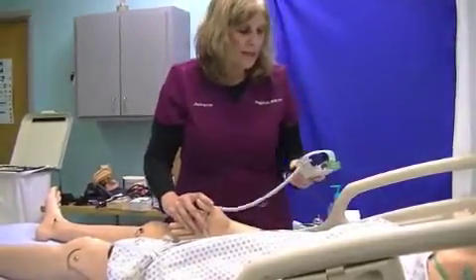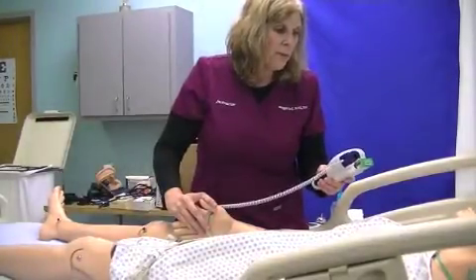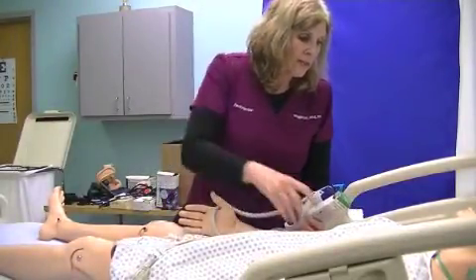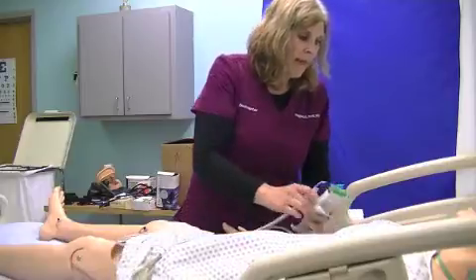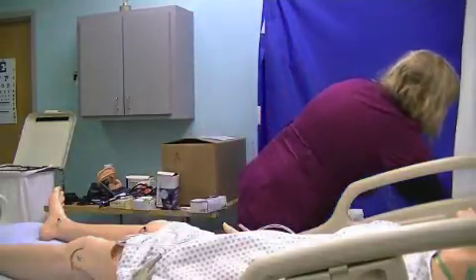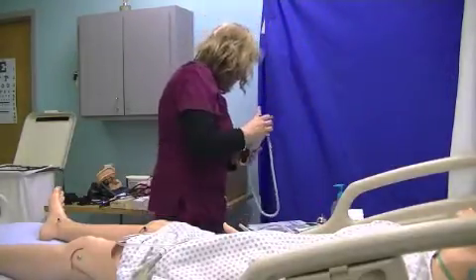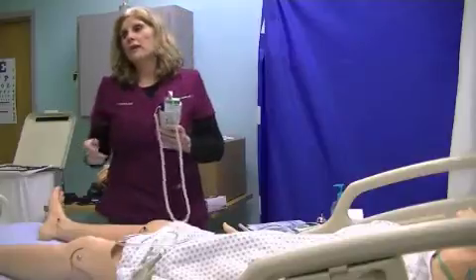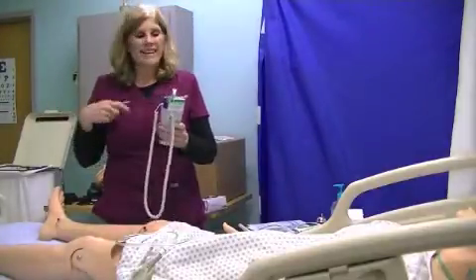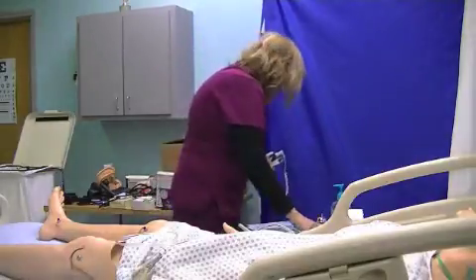Because this mannequin doesn't have a temperature to it, it won't beep, but it will actually beep when it's done. And then, of course, we can push the button to get the sheath off the thermometer and put it back in. If you wait too long when you're taking the temperature and leave the probe out too long, it will start going off.